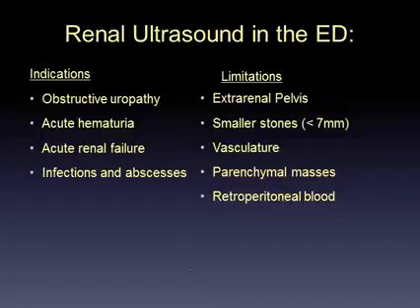With experience, it may be used in the assessment of acute hematuria in patients with renal failure and in identifying abscesses and infections. With experience, more global assessment of kidney function can be made using Doppler flow and so forth. However, that's probably best used by the experienced and advanced user.